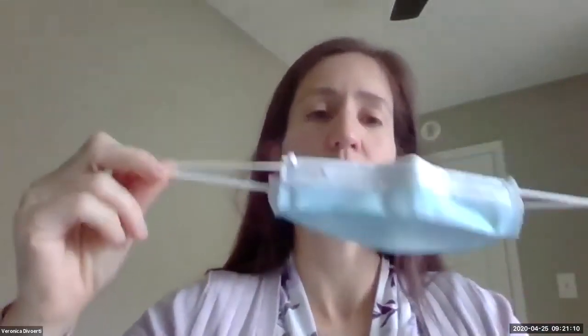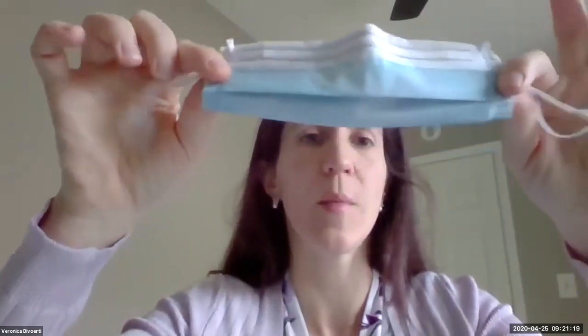You can feel free to bend the mask this way. For storage, you can put the mask on a paper bag, put it inside, and place it in a dry, cool, dark area and let it dry out.